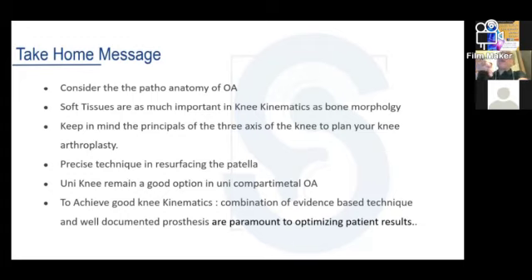In the mobile plateau, the lateral condyle is in the same position, but it turns around the axis of the tibia. And in the medial constraint, the axis is in the medial plateau. It's different. You have more flexibility in the medial constrained prosthesis.